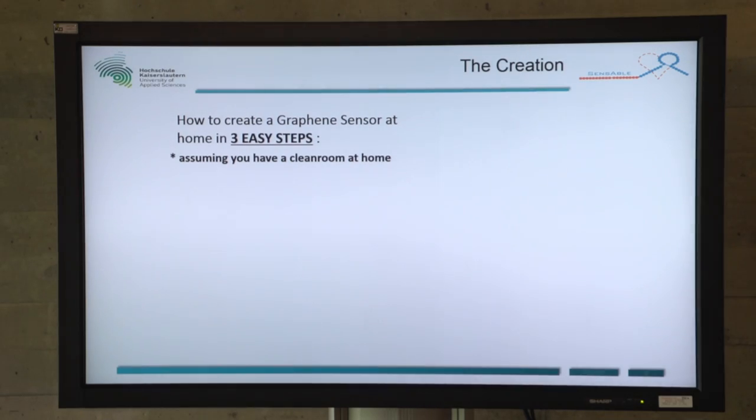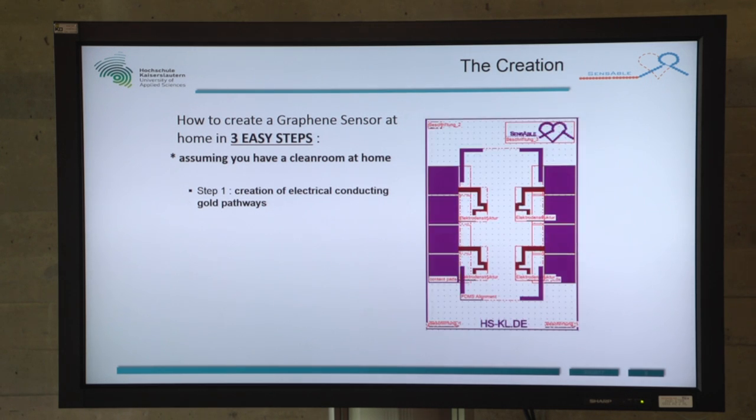How to create a graphene sensor in three steps — and probably a clean room. Step one: creation of the electrical conducting gold pads, as you can see here. Step two: protecting the structures with a glass layer. And step three: we coated our sensor with graphene oxide.